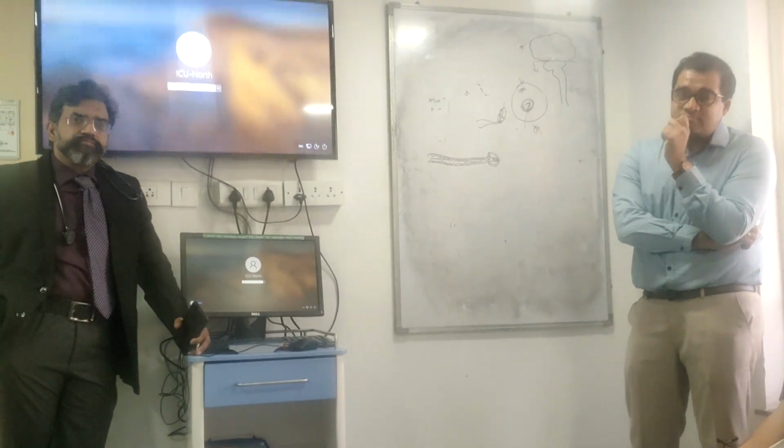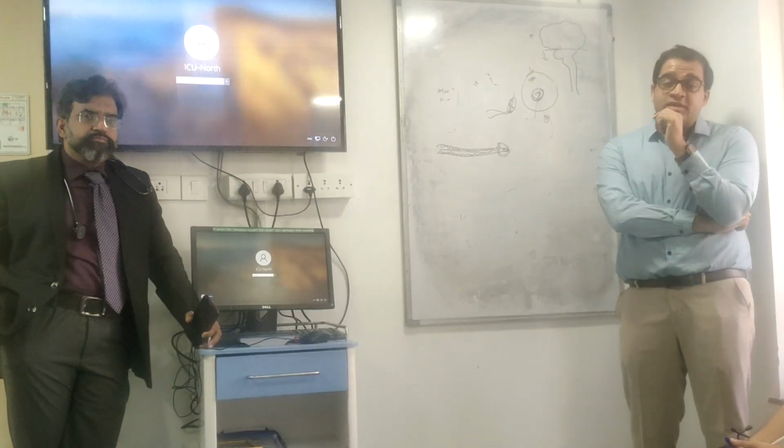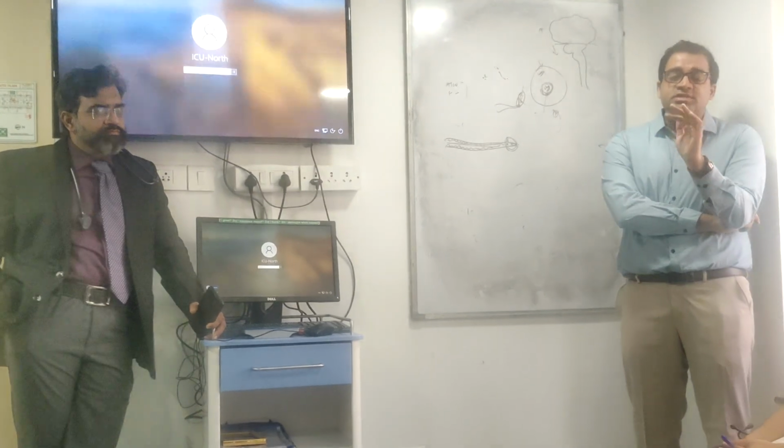Ideally, we have to send 2 sets for any septic shock patient. Methodologically, there are expensive problems, but yes, 2 sets is ideal. Avoid sending 1 set when you're suspecting sepsis.